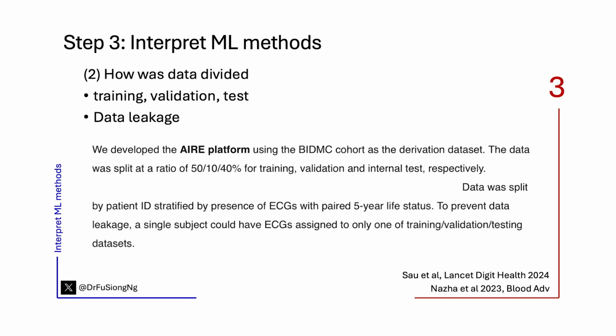Ideally, they report an external test set. Have they taken a data set from another hospital to see whether it transfers well to another form of data set? In our example, we had a sort of split here that I will show you, but it's worth understanding how that was done.